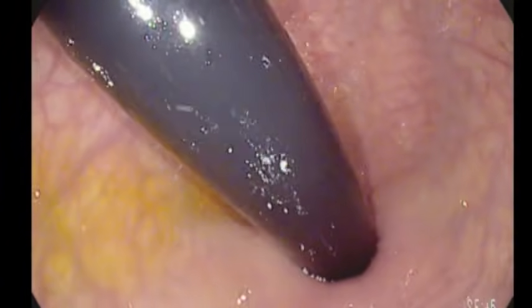Here's a retroflex view of the anal canal, an important routine procedure to check for hemorrhoids and colonic polyps. Here's the last epithelial transition of the gastrointestinal system.